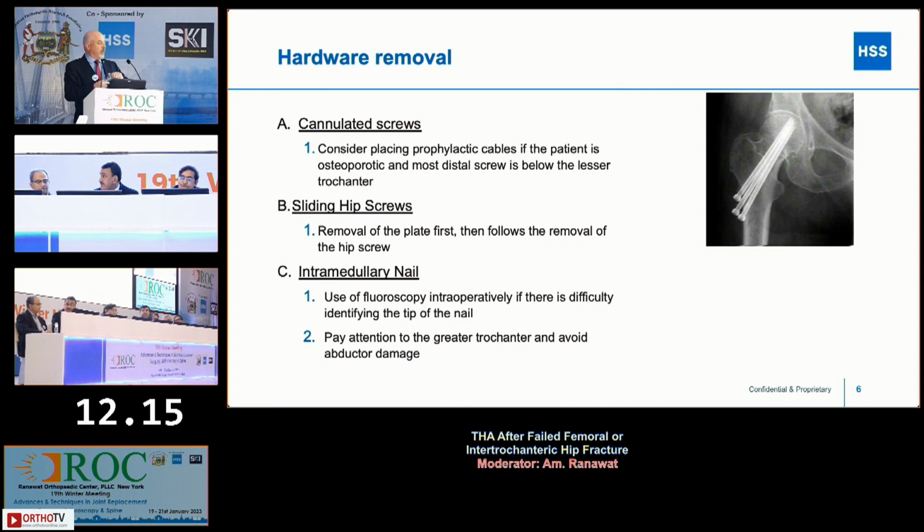Anybody want to argue with that? So I think the key is to recognize that the bone is sclerotic. It doesn't accept the broaches normally, and if you just go straight to the broach, you might get yourself into some trouble, right? Yes, in such situations, the high-speed burr is a very useful tool. It is, absolutely, 100%, right? So I think I use it primarily as well, right? So I have a burr open all the time.